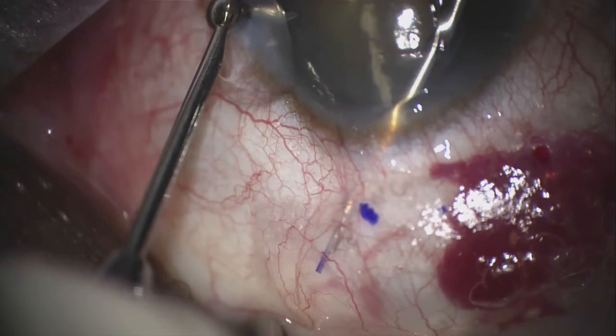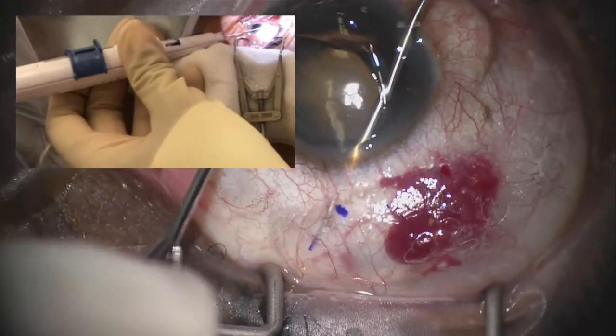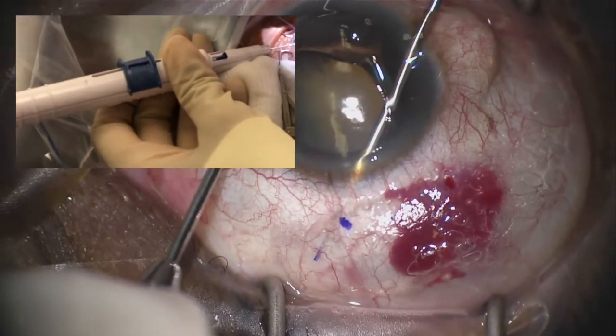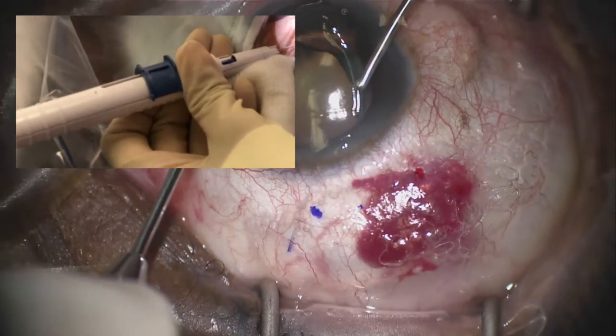Relax the tension in your hand, and as you release — typically midway while deploying the blue slider — you will have more deliberate control and finesse as you then pull the inserter away.